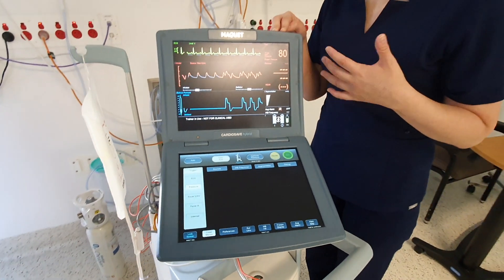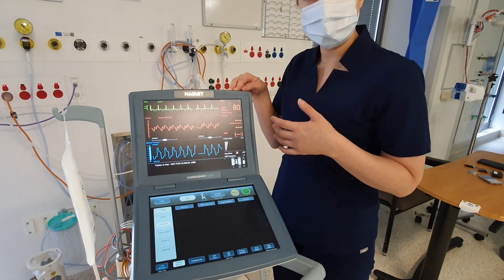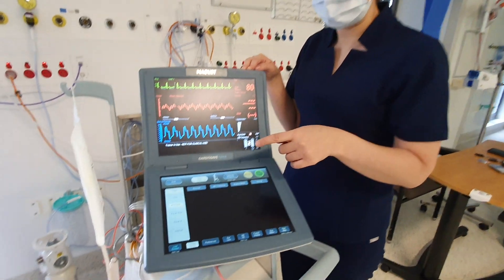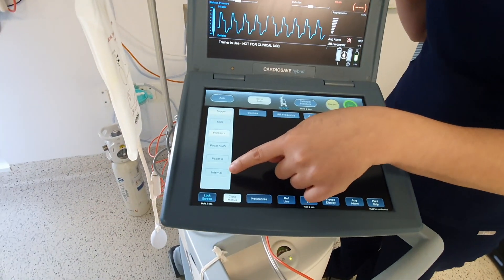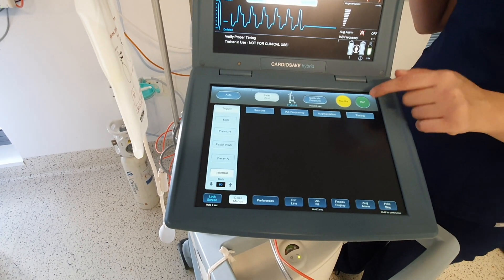If you're doing this for a CALS — a cardiothoracic advanced life support situation — and you have a balloon pump, once the chest is open you can switch to internal trigger. That is just down the bottom here; select internal and remember to hit start.